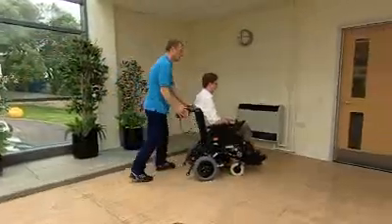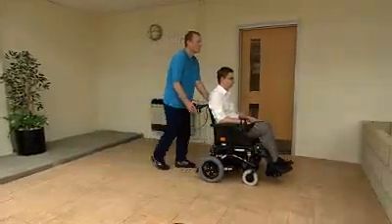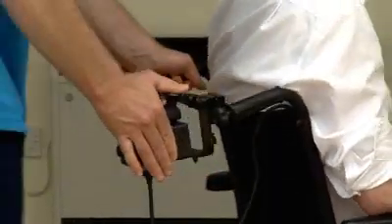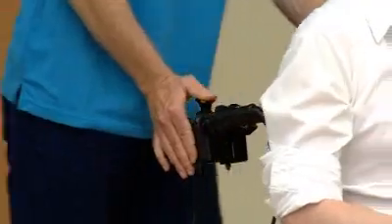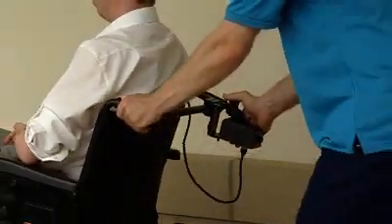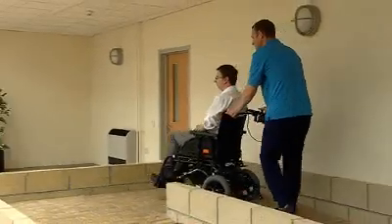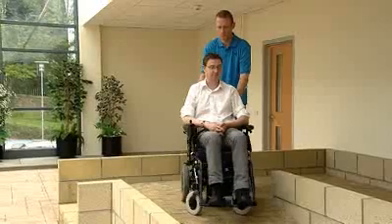Move the joystick in the direction you wish to travel and at the same time control the speed of the wheelchair to match your walking pace. Move your thumb slowly to change direction and speed, avoiding rapid joystick movements as this will result in rapid changes in speed and direction. At all times, continue to grip the push handle and controller.